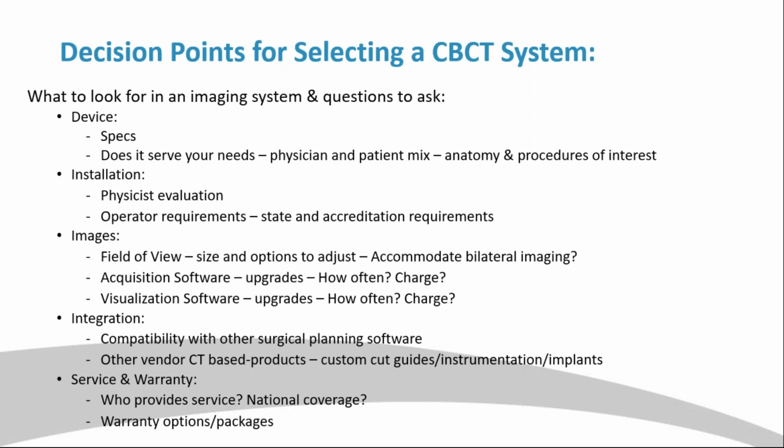Same thing about software, so acquisition software and how pictures are taken, and then visualization software about how you look at those images. Ask questions about upgrades, ask about software implications. Is there a charge for these things? And then look at integration.